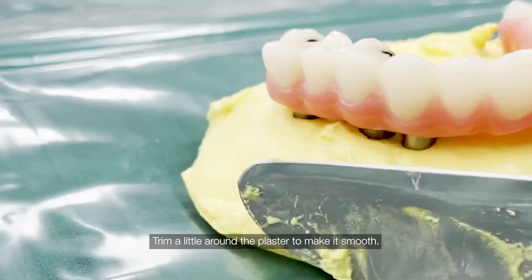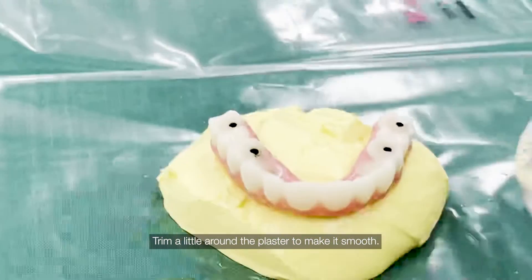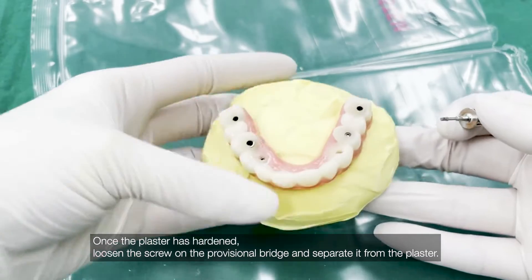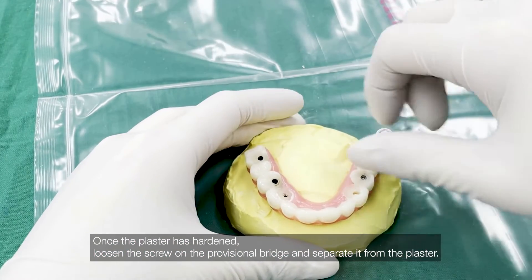Trim a little around the plaster to make it smooth. Once the plaster has hardened, loosen the screw on the provisional bridge and separate it from the plaster.